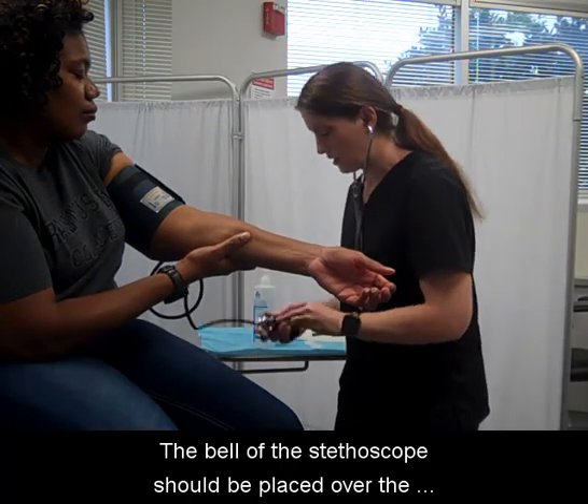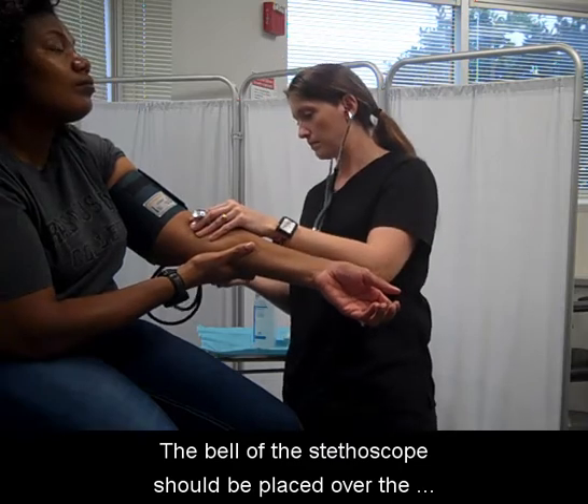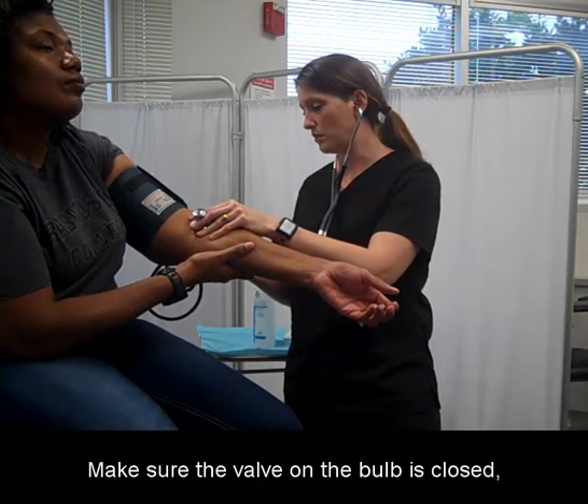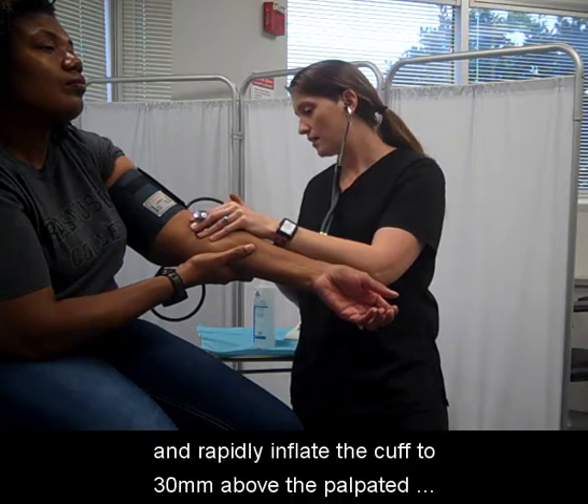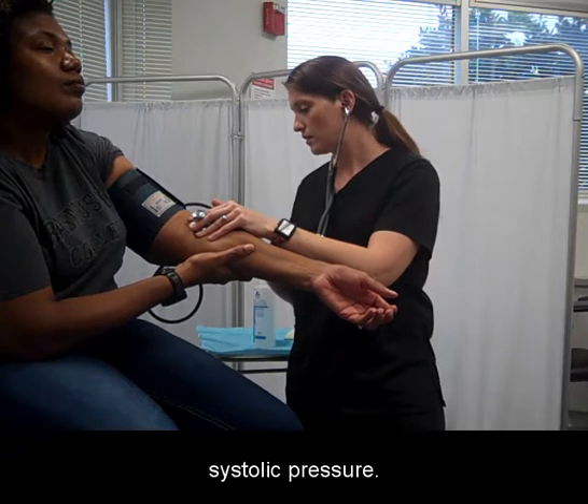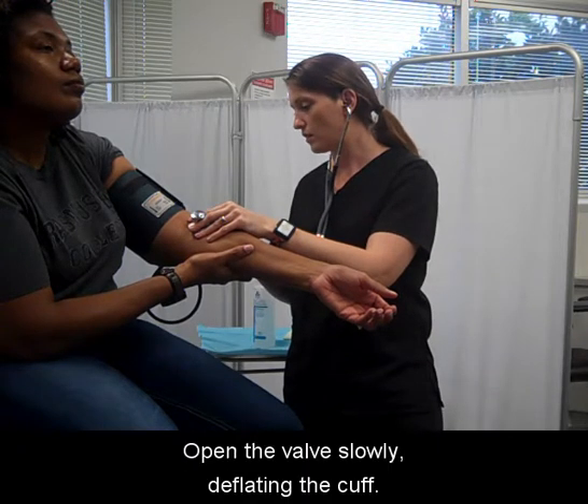The bell of the stethoscope should be placed over the brachial artery with a good seal using light pressure. Make sure the valve on the bulb is closed and rapidly inflate the cuff to 30 above the palpated systolic pressure. Open the valve, slowly deflating the cuff.